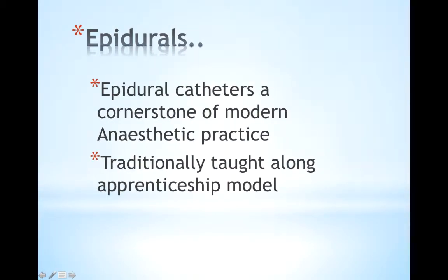So, being able to place and utilise an epidural catheter remains a cornerstone of modern anaesthetic practice. Traditionally, the placement of epidural catheters has been taught along an apprenticeship model, very much in the vein of the see one, do one, teach one.